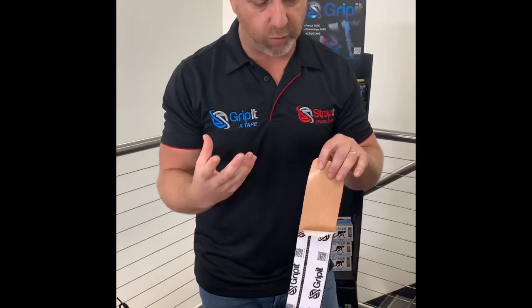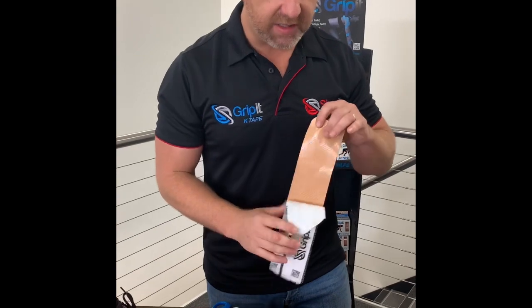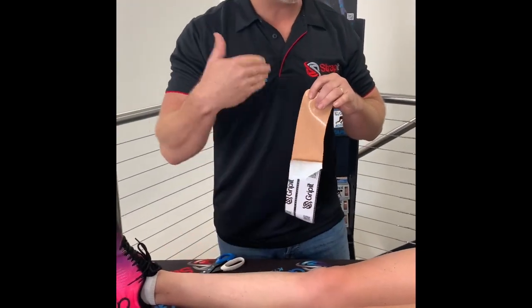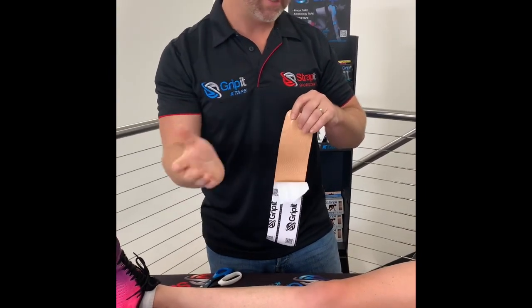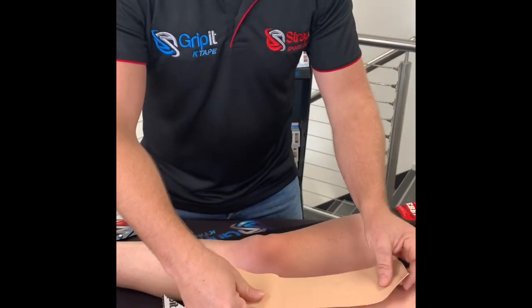More for those sweaters or in those countries that have very high humidity. Now, let's look at the knee application for the anterior chain. Very basic technique. The knee's a hinge joint, so we're only looking for one plane of motion that we're trying to change. Now, if we just come in close here, we need to prepare the anchor up the leg.